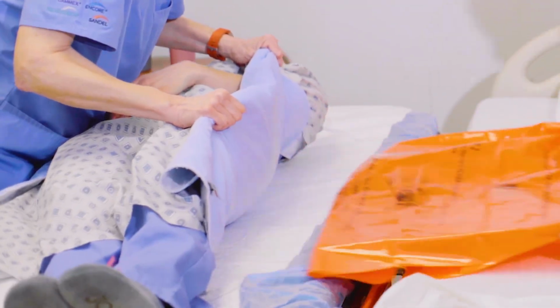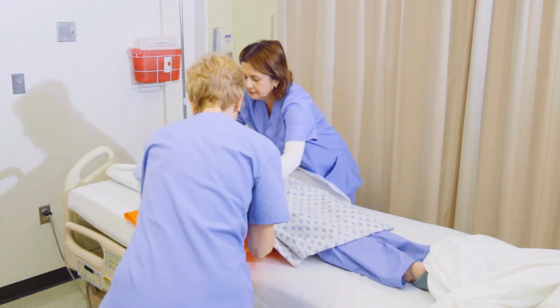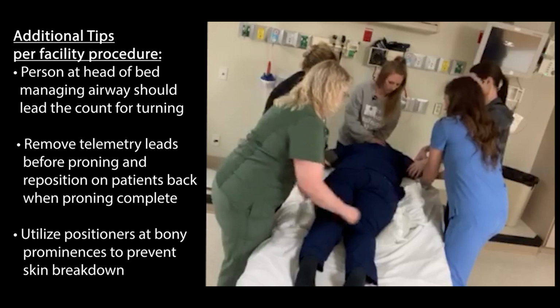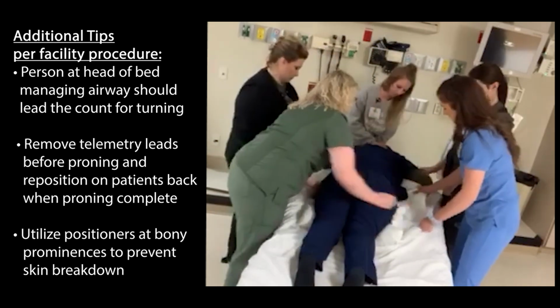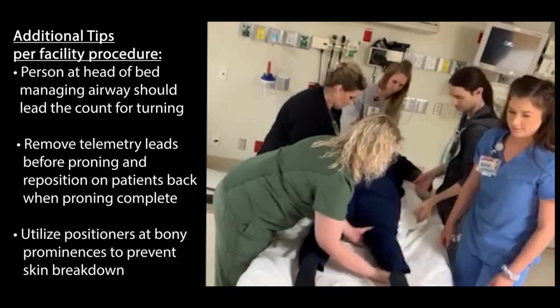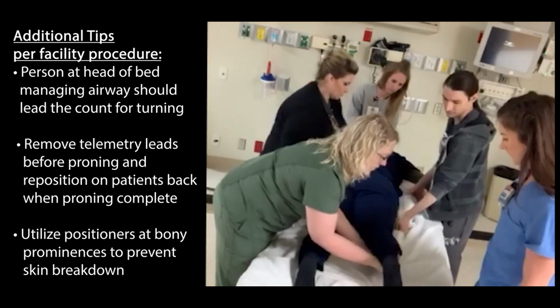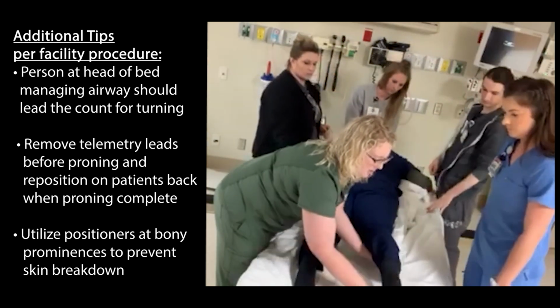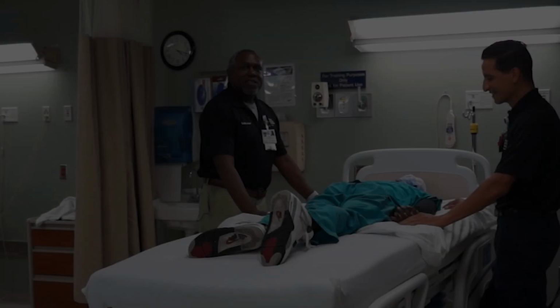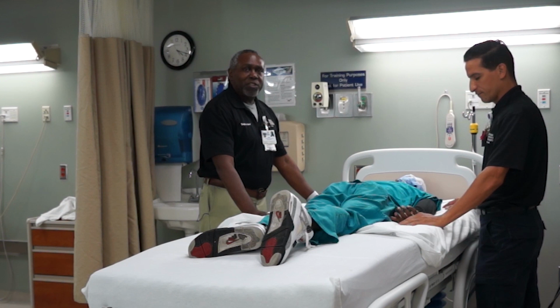After completion of patient repositioning or transfer, remove the Z slider from under the patient. Arms, head, and hips should be supported to maintain proper alignment and avoid pressure injuries. This completes the process of proning a patient on the same surface using the Z slider.